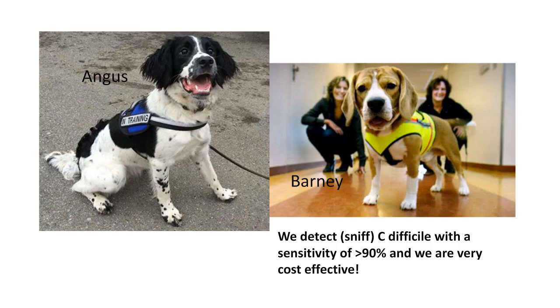So if you have a GDH negative toxin A and B, I would think that you most likely have a non-specific false positive reaction in your toxin A and B. We've seen some of this in IBD patients and in people with Crohn's. They have some false lack of specificity in some of the enzyme immunoassays. Okay, thank you, Dr. Morgan.